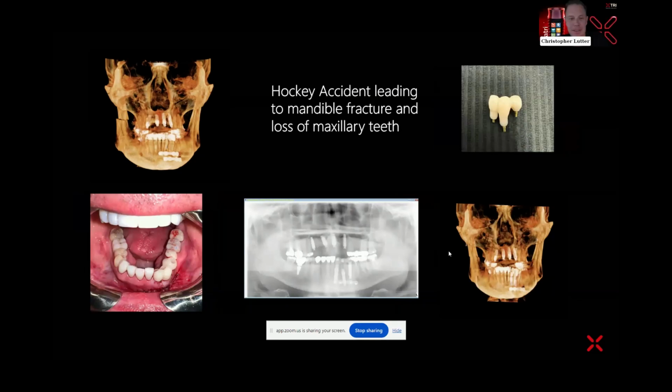Yes, very subcrestal, and obviously a fantastic prosthetic outcome too. Yeah, so I think that in this case, it would have been tough to do this any other way, but with photogrammetry, we were able to give this patient what he wanted, immediate results.